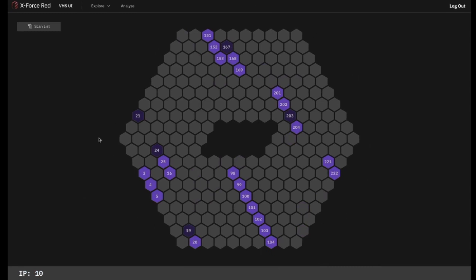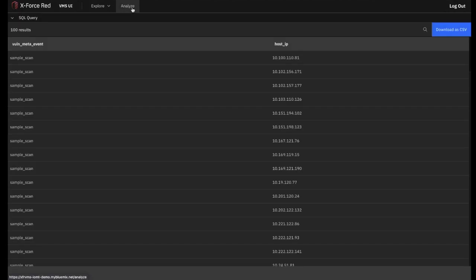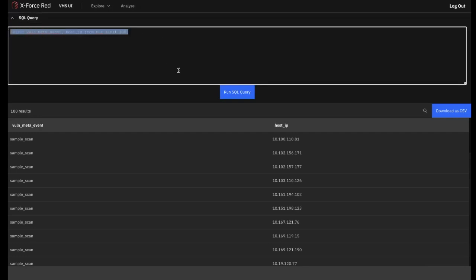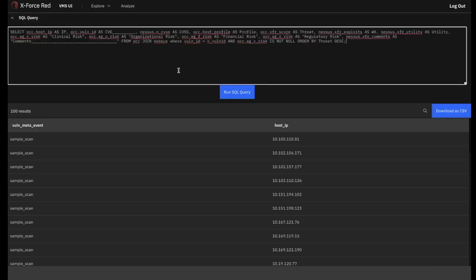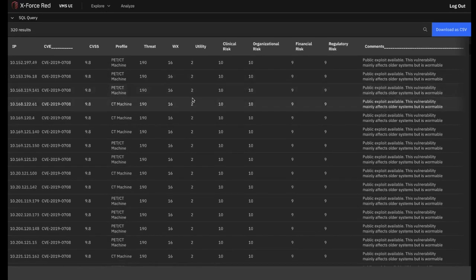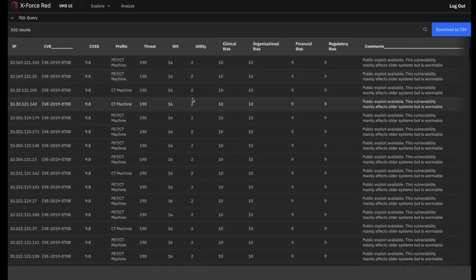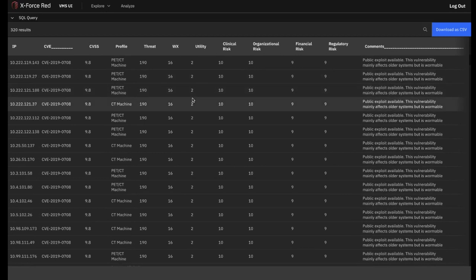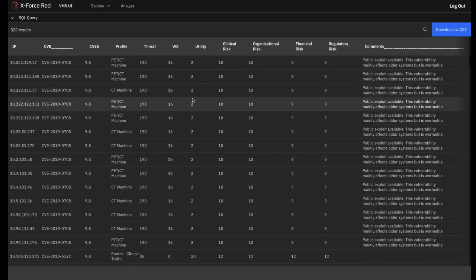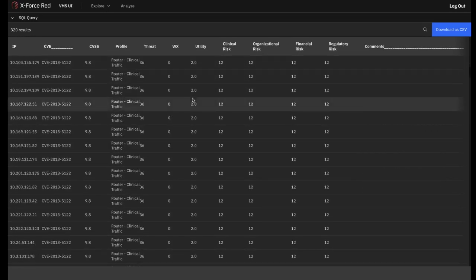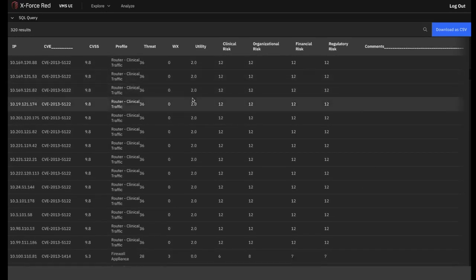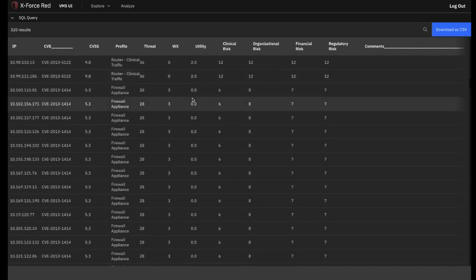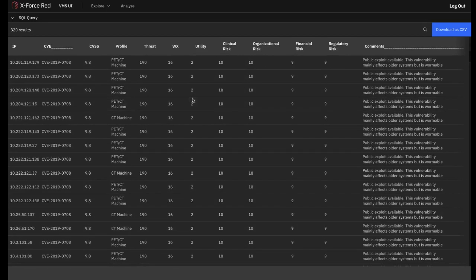Besides the honeycomb UI, you can also visualize all your results using the analyze function. By clicking this, you load a page where you enter a simple SQL query that will generate a complete and granular table of results. This report includes all information you need about every instance of a vulnerability that has been discovered and analyzed using both X-Force Red's technical analytics and the CCOM2 shared clinical security analytics platform.